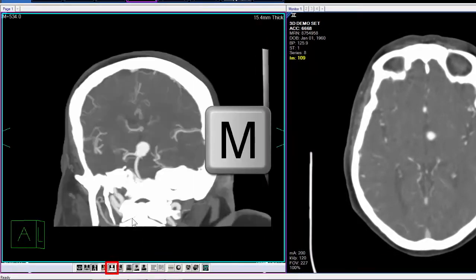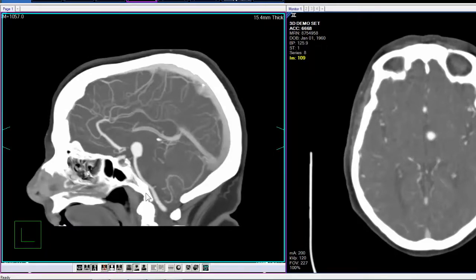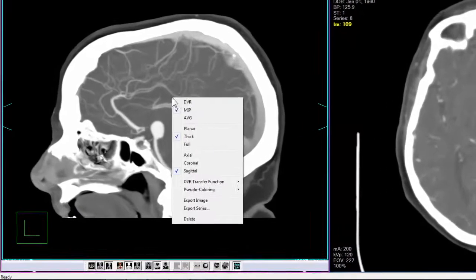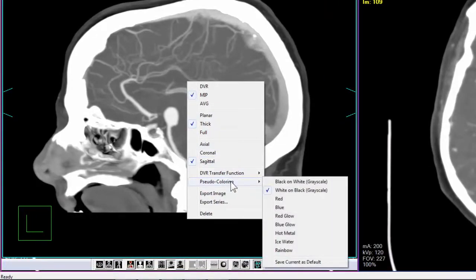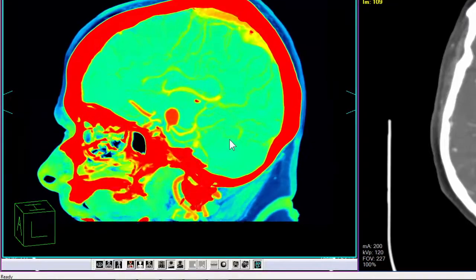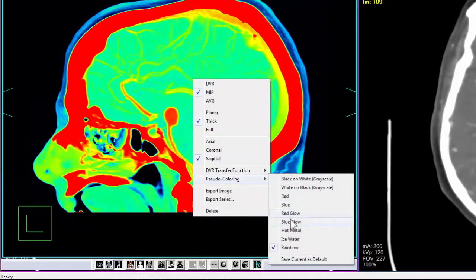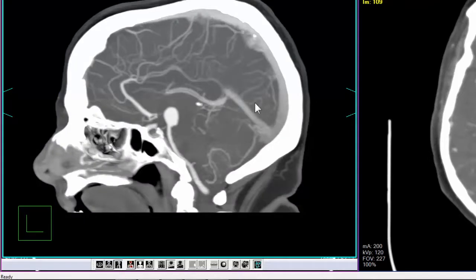This is the MIP toolbar icon. Its keyboard shortcut is the letter M. MIP displays the data as a maximum intensity projection. Pseudo color schemes can be applied to MIP projections. To change the pseudo color scheme, access the right-click context menu, click pseudo coloring, and select from the available presets. Defaults can also be configured from this menu.